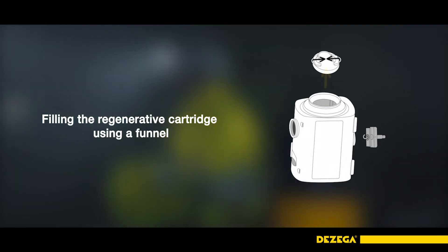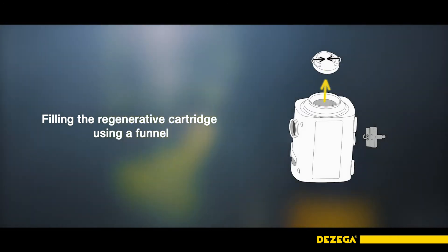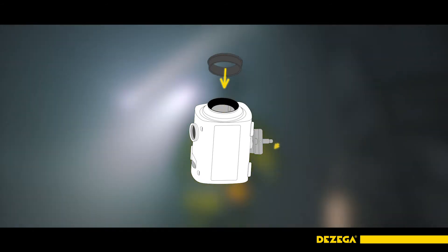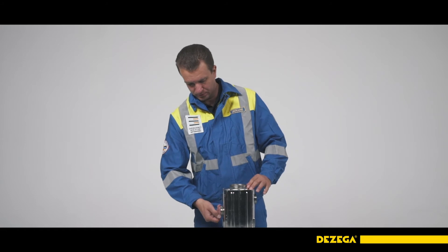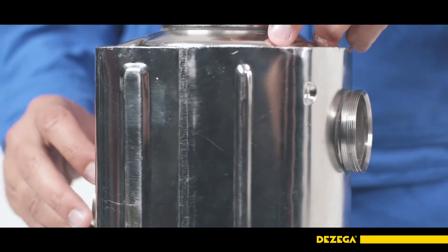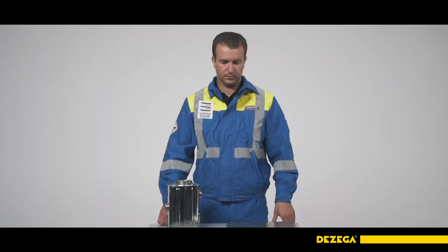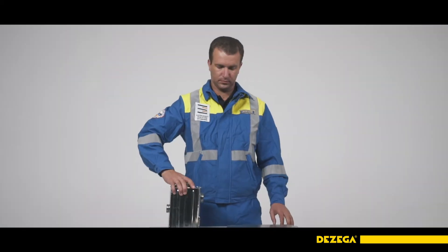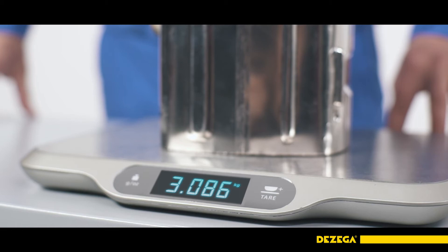The cartridge can also be filled using a funnel. When compacting the last portions of the absorbent, slightly press it with your fingers through the neck while simultaneously tapping the side of the cartridge casing with the palm of your other hand. The level of the absorbent should coincide with the edge of the neck. After installing the plug, remove the remains of the absorbent through the necks by shaking the cartridge. To remove small fractions of the absorbent, blow air through the necks for one minute at a flow rate of 200 to 400 dm³ per minute. Weigh the cartridge with an accuracy of 5 grams and compare to its weight before filling. The weight of the absorbent should be at least 2.3 kilograms.